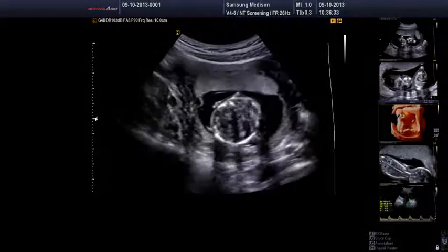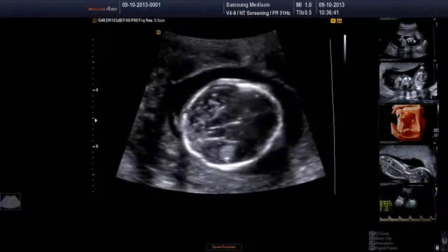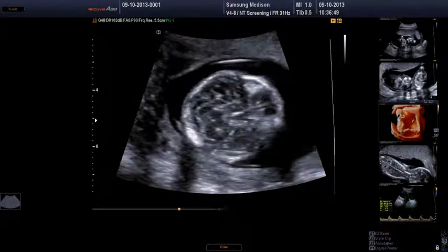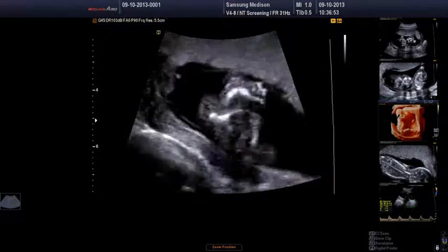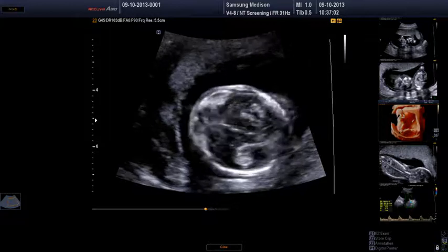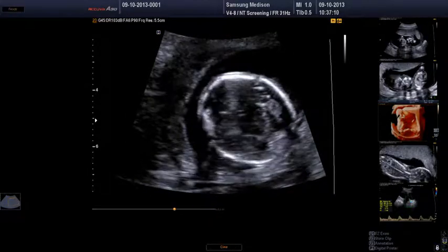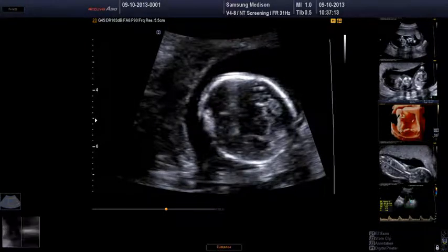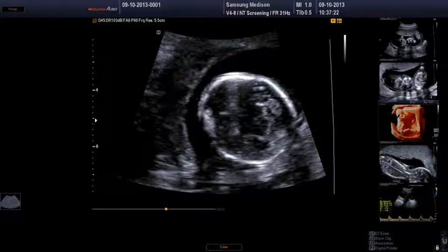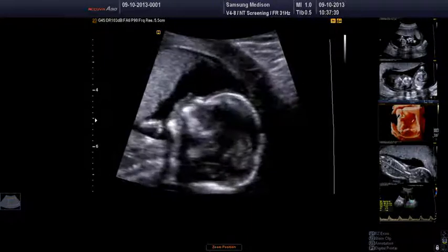Just some other bits and pieces from a biometry perspective. We're looking at the head here in cross-section, and I think it's useful to get into the habit of coming through the head. I've just frozen here to show you the posterior fossa that we saw in passing there. So let me just rotate the probe a little bit. Okay, so I obviously want to get up to the level where I can measure the BPD reasonably accurately. I'm a little bit oblique there, but just to give you some idea of where we're at. I can measure across there. Okay. Good.